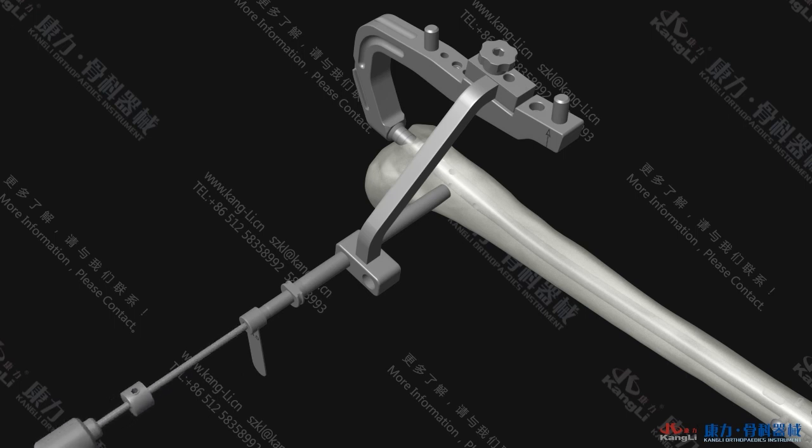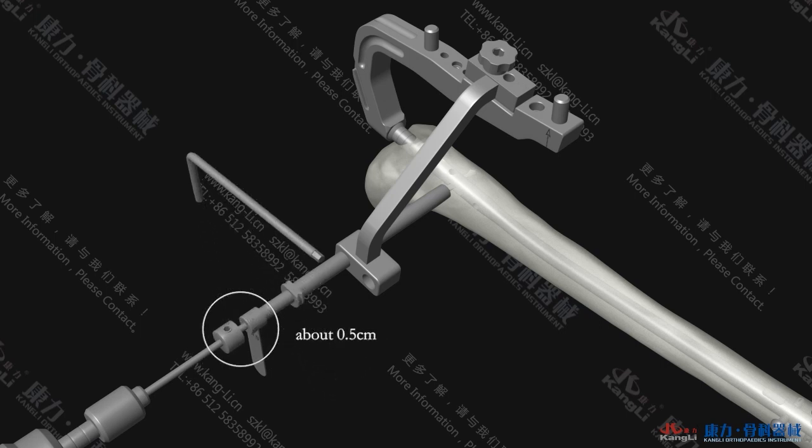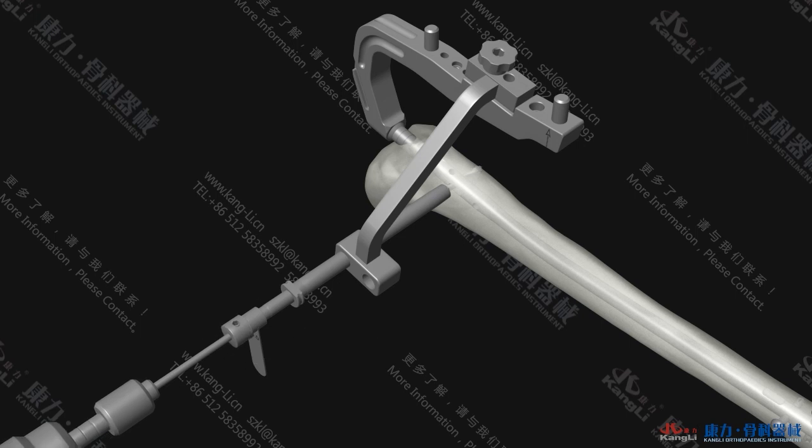When the first layer of the bone cortex is drilled through and the drill bit reaches the inner wall of the contralateral cortical bone, adjust the distance between the ball spike on the Φ4.0 drill bit and the Φ4.0 inner sleeve to about 0.5 cm using an SL wrench to protect the soft tissue of the contralateral skin. Then continue drilling until the contralateral bone cortex is drilled through.